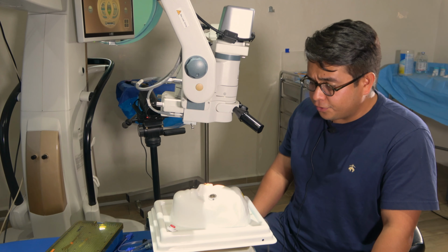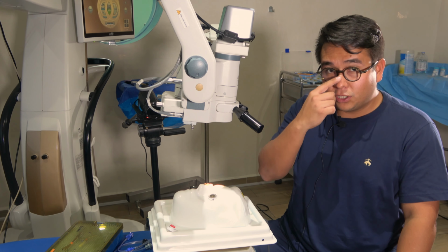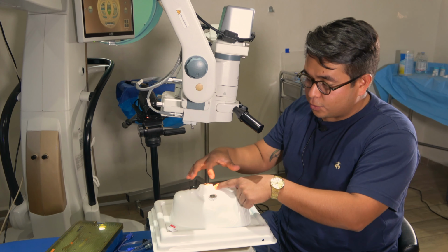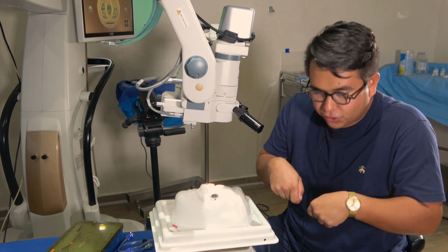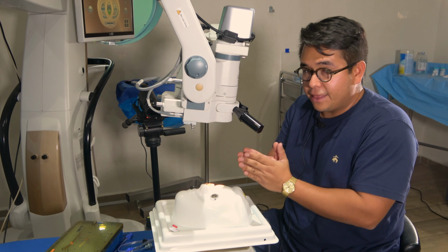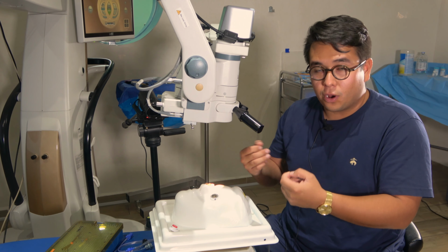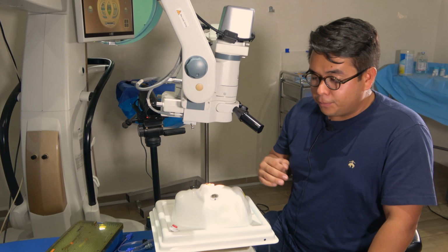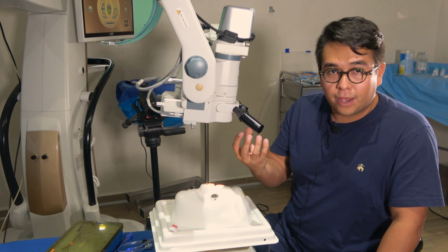Okay? Another thing that is important to see before the surgery is the nose of the patient and the eyebrow arc in the superior part, because patients with atrophy of the orbital tissues will have an eye like if you were doing surgery into a bottle. So it's really important that in those cases you plan really well the patient's position, also the side where you're going to put your trocars, and even with the anesthetic block, you can put a little bit more liquid behind the eye so you can have a better position of the eye for the surgery.